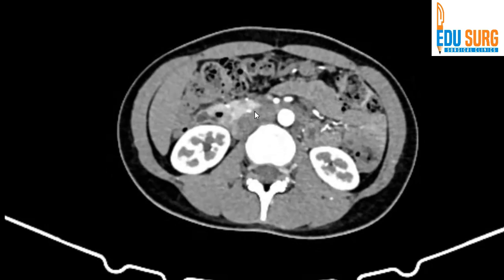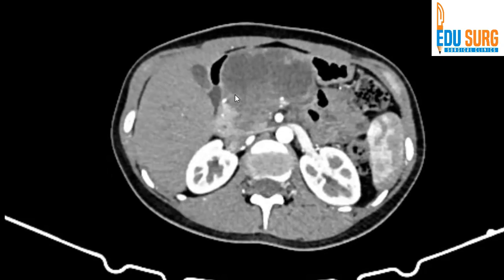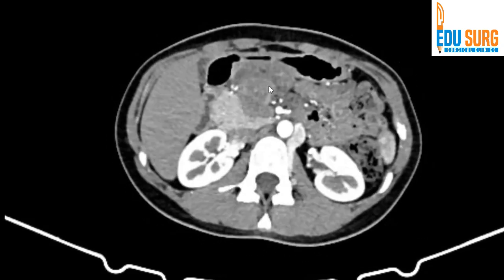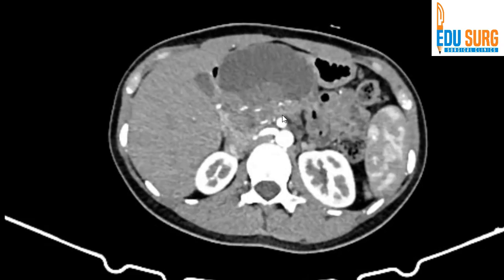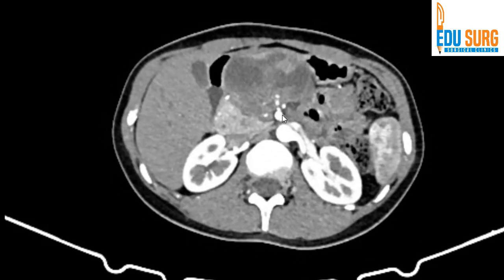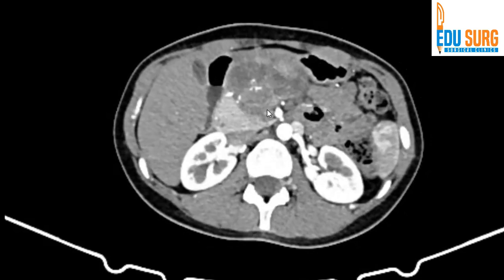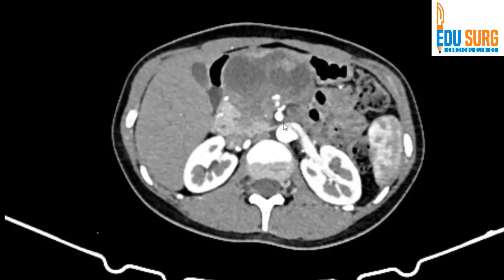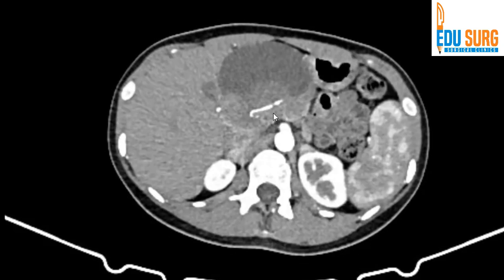This is the uncinate part of the pancreas. You can see that it is relatively free from the tumor, but there is an area where the uncinate is involved or compressed by the tumor. Like I said, this is a young girl, and the most common tumor that presents in this age group is a SPEN — a solid pseudopapillary epithelial neoplasm. There are tumors going right up to the uncinate. The superior mesenteric artery is free from the tumor; there is a plane between the SMA and the tumor.